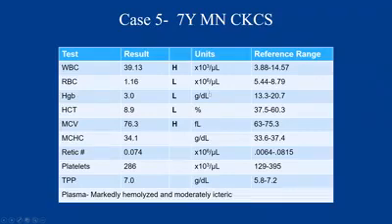So we can see here that the patient has a moderate increase in white cells, so a moderate leukocytosis, no differential right now. The patient is pretty markedly anemic, so our red cell count, hemoglobin, and hematocrit are all markedly decreased. Our MCV is up a little bit, so it's a little bit macrocytic, but not markedly so. And the patient currently is not regenerative, okay? Our reticulocyte count is normal, and our platelet count is within reference interval. So again, notable findings include this marked anemia and this moderate leukocytosis. Our plasma was markedly hemolyzed and moderately icteric.